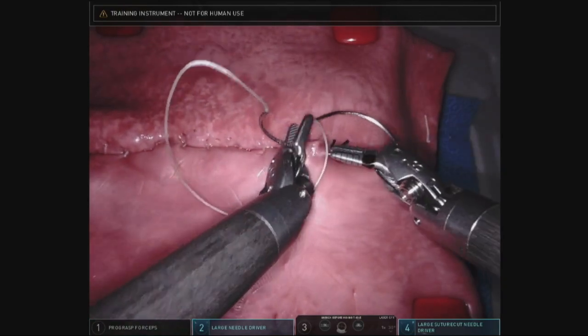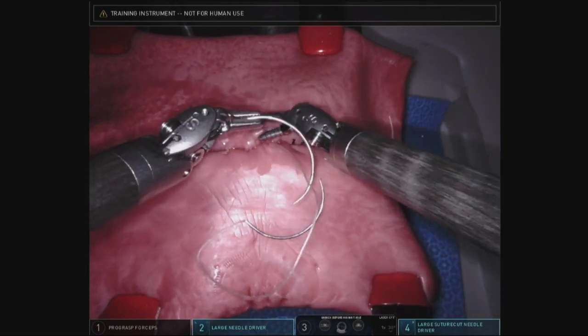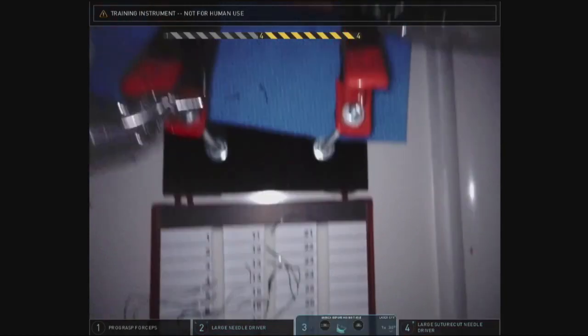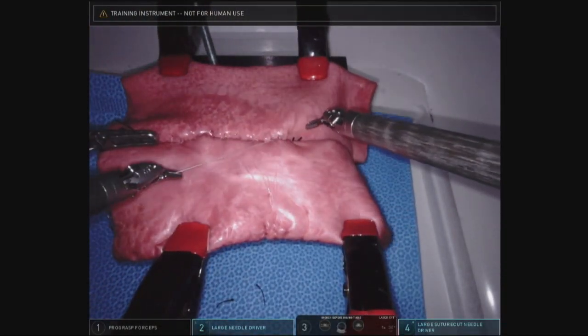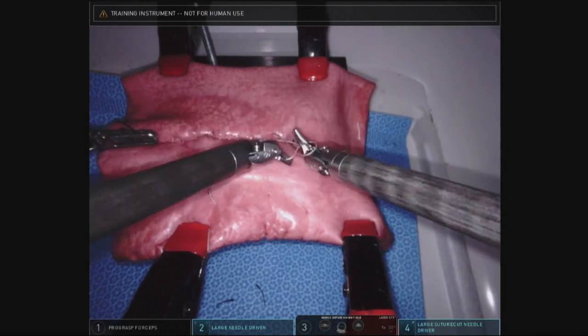This is probably the last stitch because we've reached the end of the stitch coming from the right. I'm going to tie them together. And this will complete the inner layer.